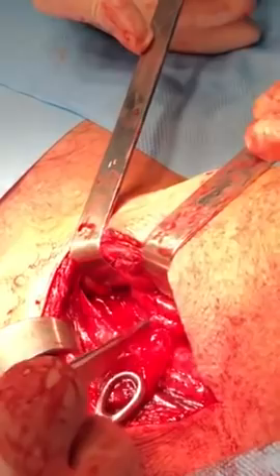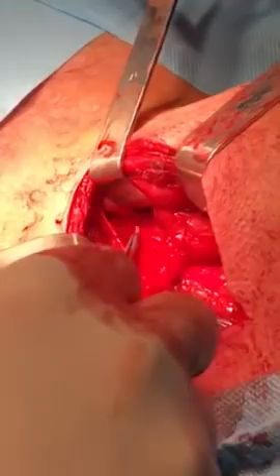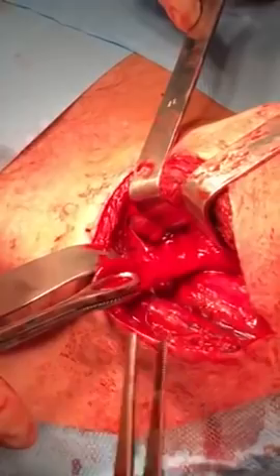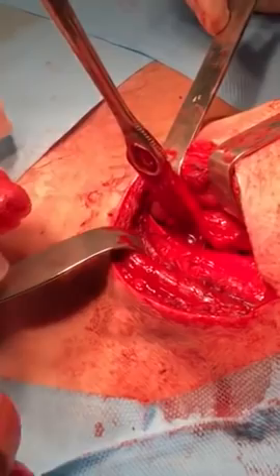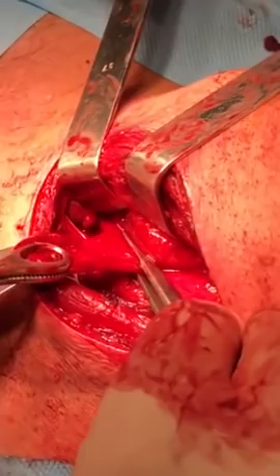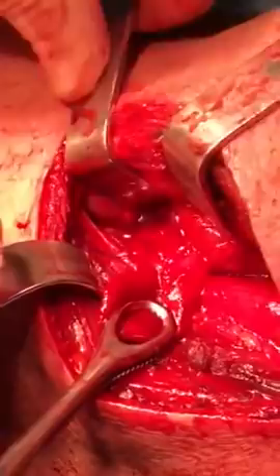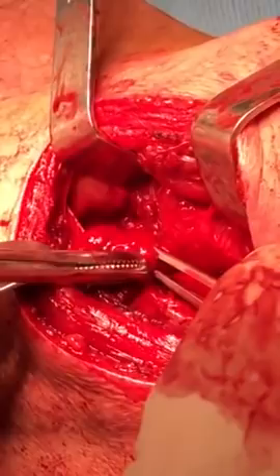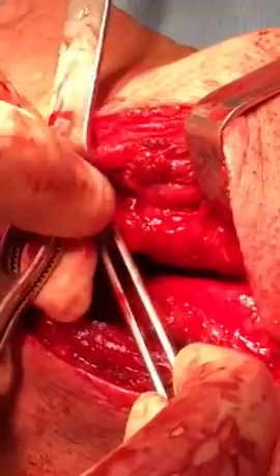The cricopharyngeus muscle and the upper esophagus are identified. Here is the pouch. For transection, the neck of the pouch must be correctly identified. If we pull it and transect too far, there will be stenosis of the esophagus. After releasing the traction, the exact junction of the neck with the esophagus becomes visible.